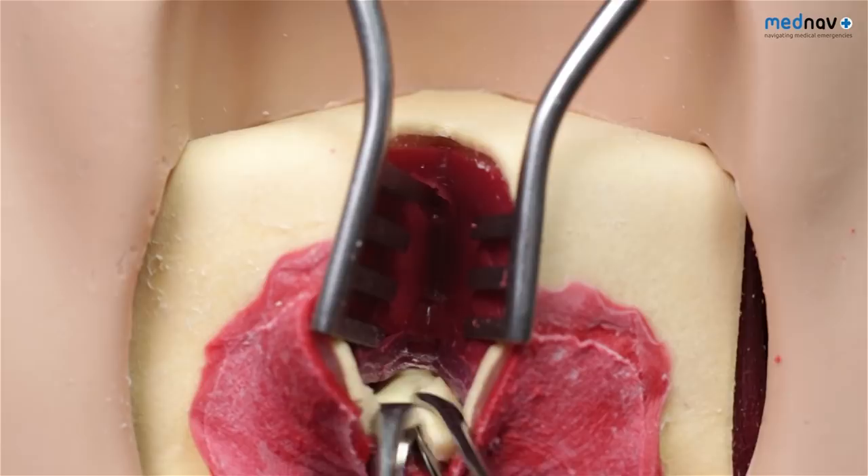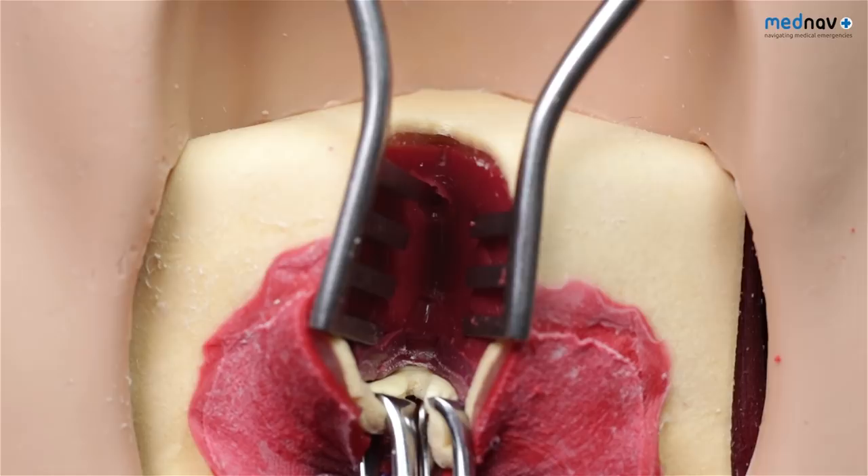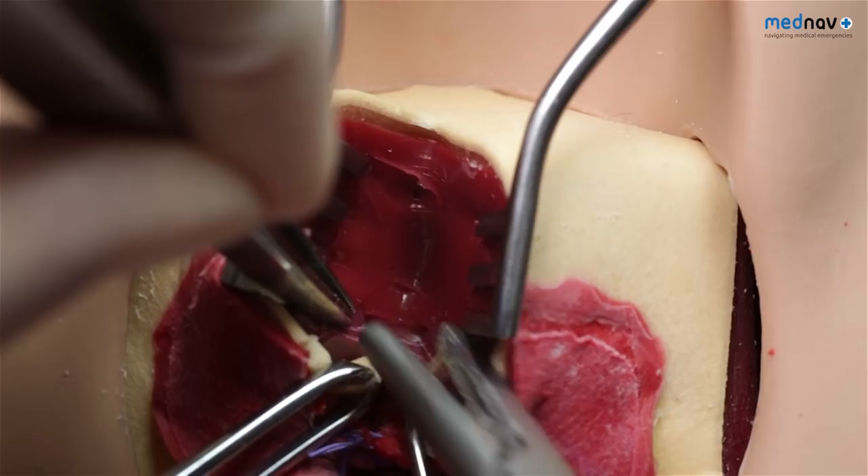The ends of the sphincter may retract, and so the placement of Allis forceps may help facilitate the repair. Take a full thickness bite of the internal anal sphincter from one side and carry on to take a full thickness bite of the other side.